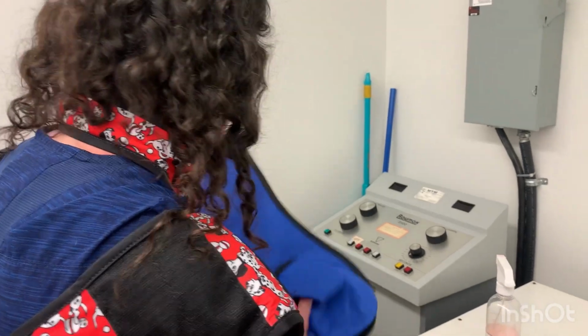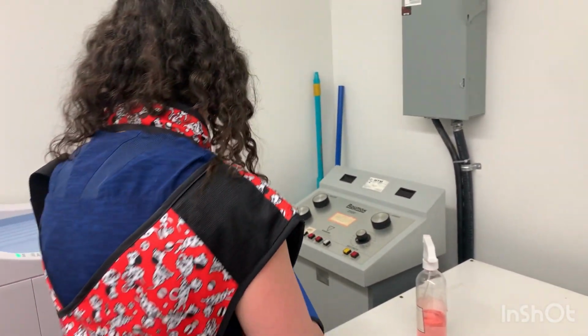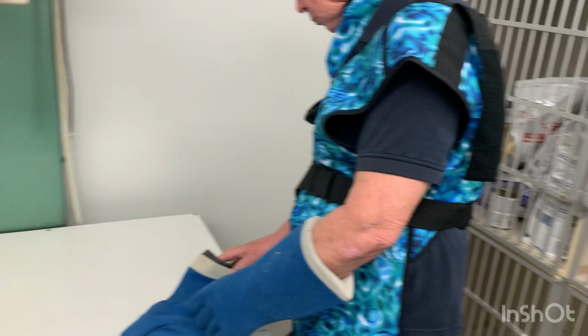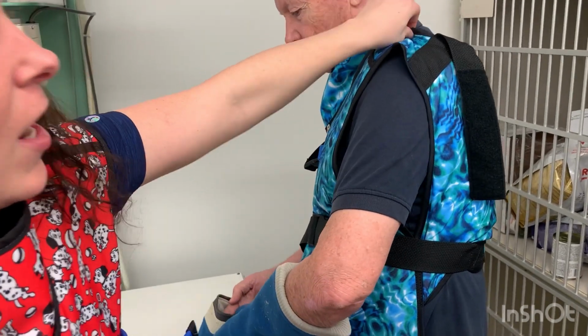And then we need to be taking, at this point, turning the machine on and adjusting our settings. So I've got my thyroid protector on, I've got my gown on. Dr. White has the same there, with his shoulder sliding off of him a little bit.